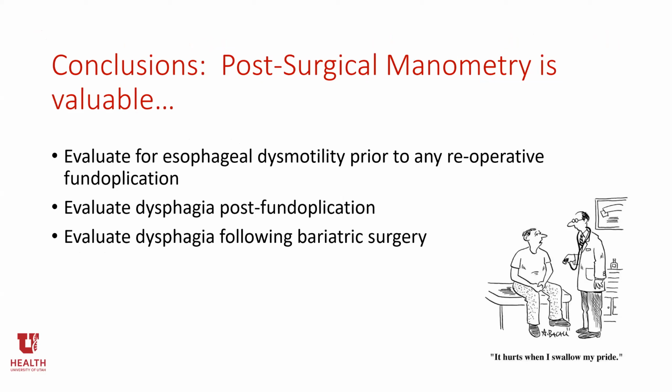In conclusion, post-surgical manometry is valuable, certainly assessing for esophageal dysmotility prior to any reoperative fundoplication, but also sometimes in the postoperative period, so post-fundoplication and following bariatric surgery if a patient experiences dysphagia. It's important to swallow your pride and remember it's not always patient factors that are the contributing etiology. You have to go back to the beginning, check everything that you did, and make sure things are appropriate.